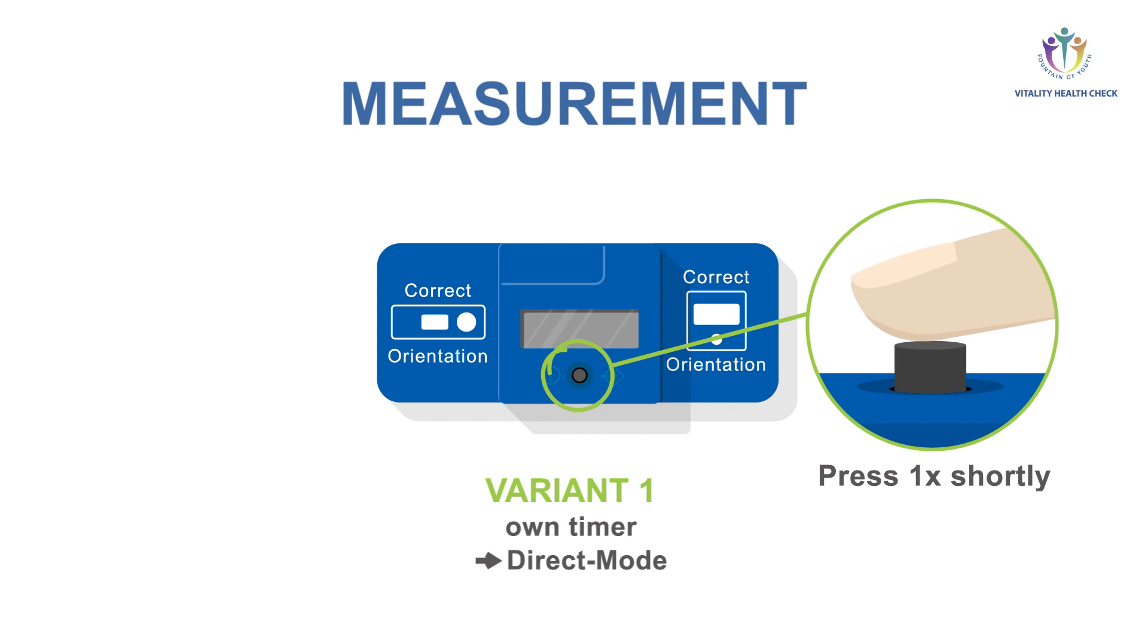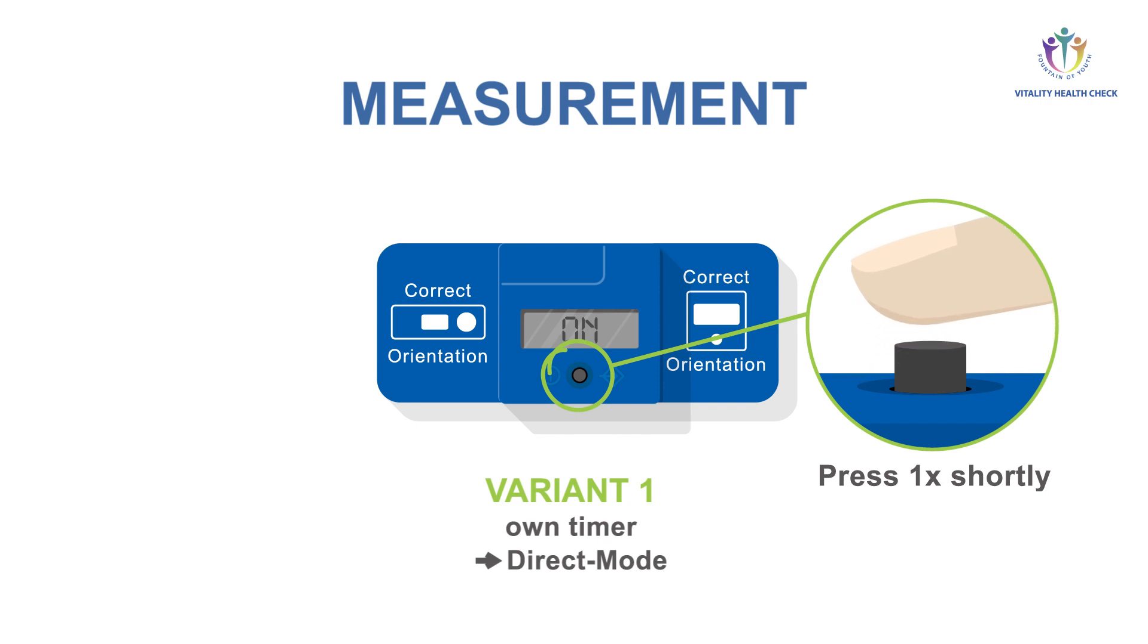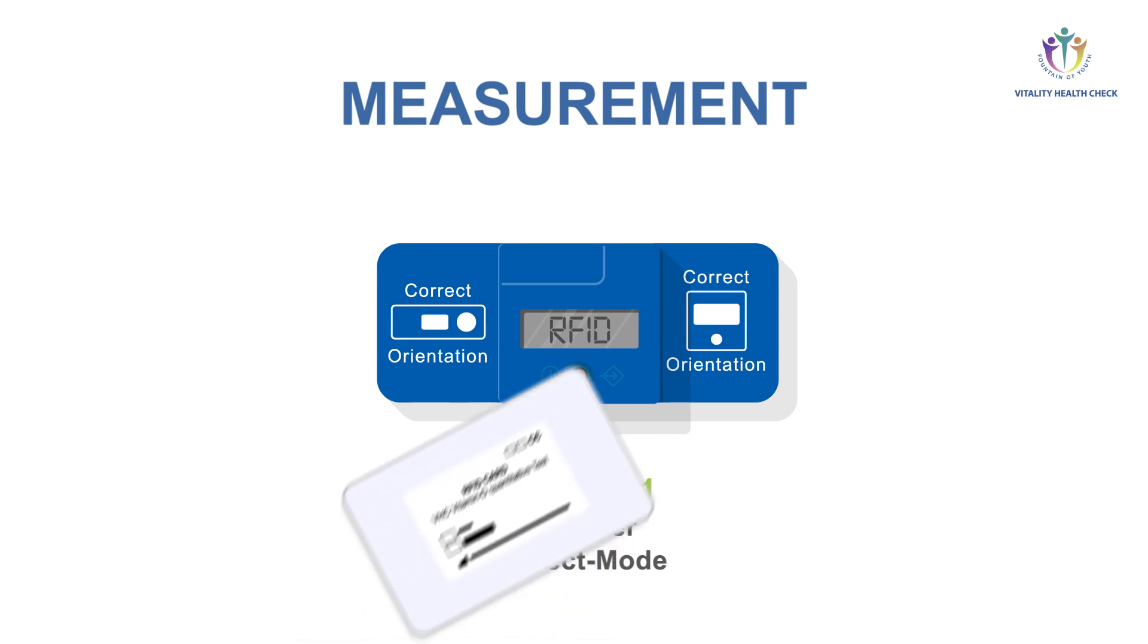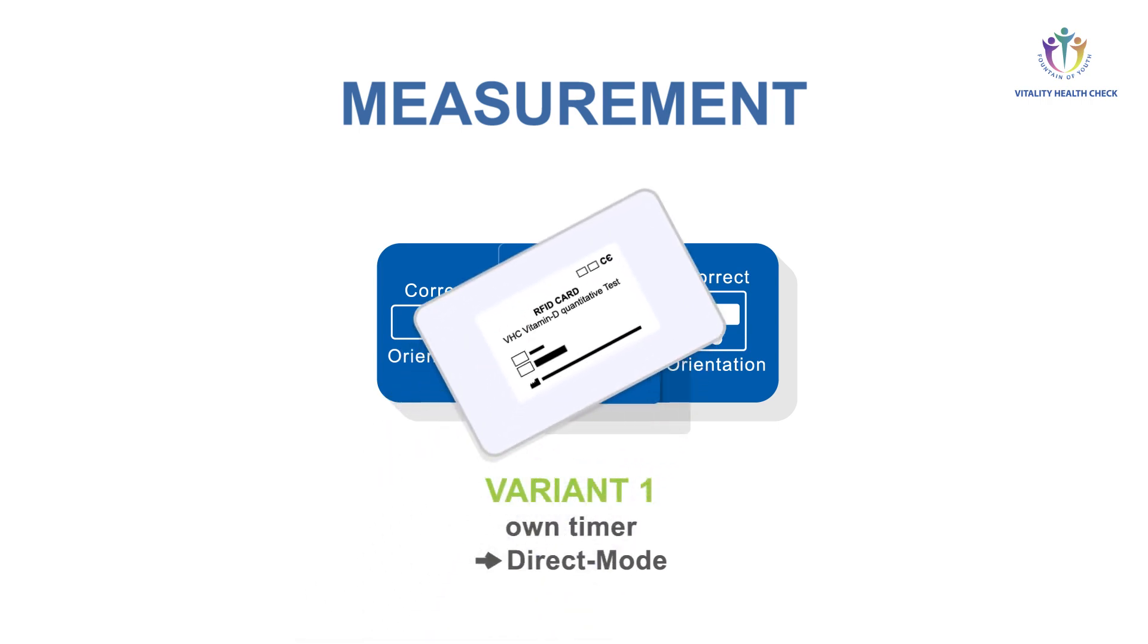After the self-test, the device shows on. To start measurement, press the button shortly, maximum 1 second. The device shows RFID. Make sure the lot numbers of RFID card and test cassette are matching. Place the RFID card on top of the VHC reader. A beep tone confirms the data transfer was successful.